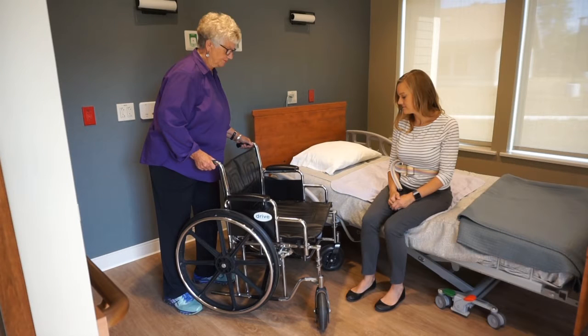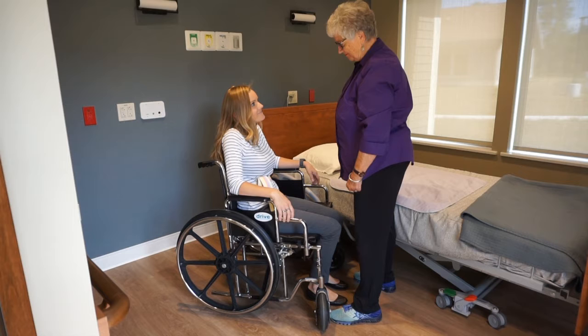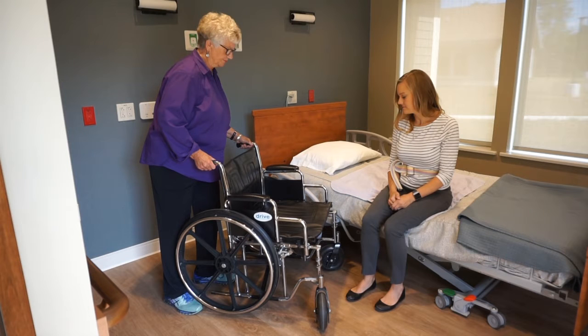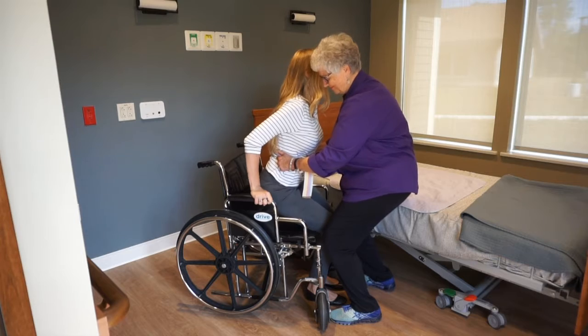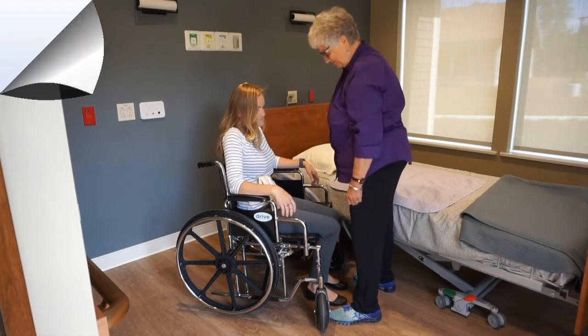Techniques for assisting a participant to transfer from sitting on one surface to another vary depending on the level of assistance needed. Some participants require a high level of assistance, and devices such as gait belts or mechanical lifts may be needed. In this video, we will demonstrate using a gait belt to assist a person to transfer from sitting on a bed or in a chair to sitting in a wheelchair.